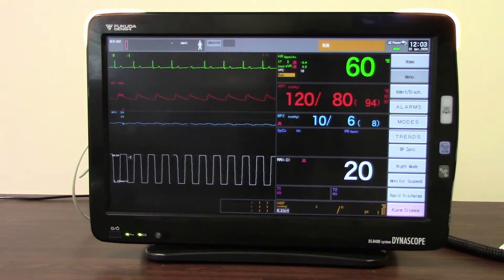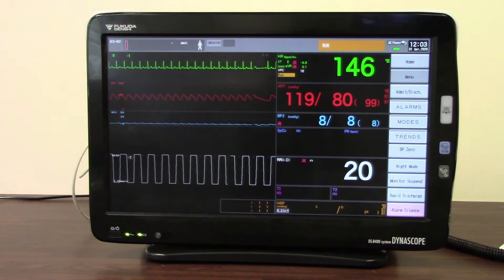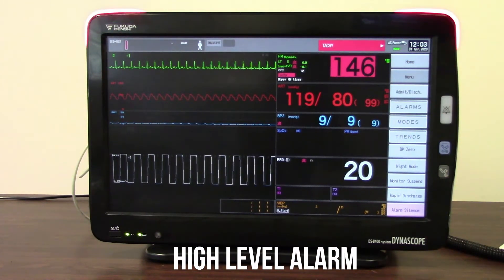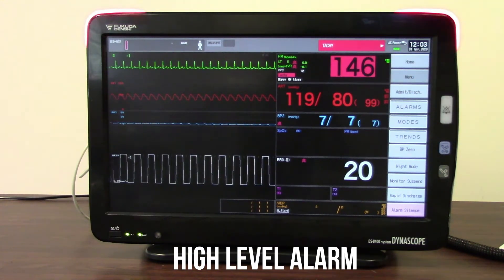The next alarm that we're going to listen to is our high level alarm. If we activate a bit of tachycardia on the monitor, you're going to see the monitor will flash red in the top corners. You can see that the parameter highlights, and also that you get an alarm message at the top.